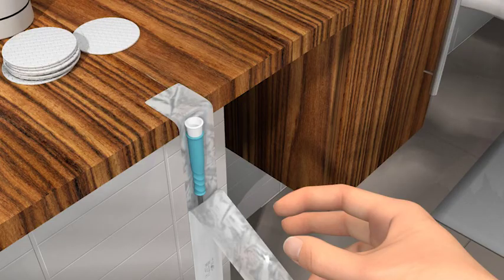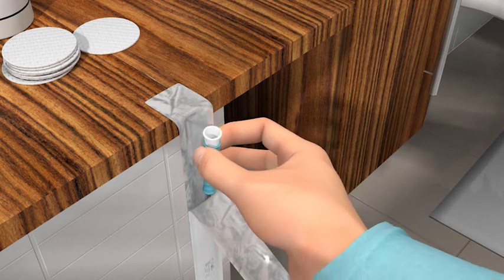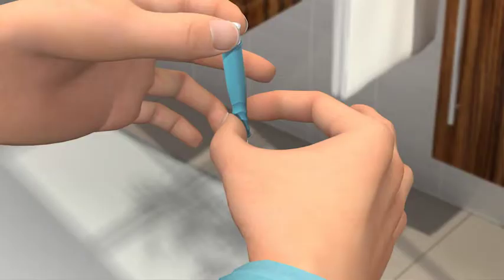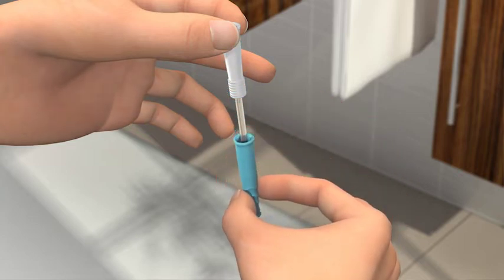Grab the turquoise insertion grip with your leading hand and lift the catheter out of the packaging. Loosen your grip of the insertion grip a bit and release it from the connector by pulling it downwards. Then pinch the insertion grip again. For optimal grip to the catheter, pinch on the wavy section of the insertion grip.